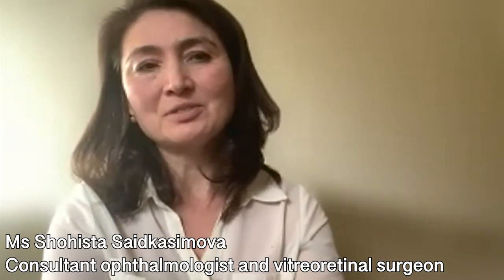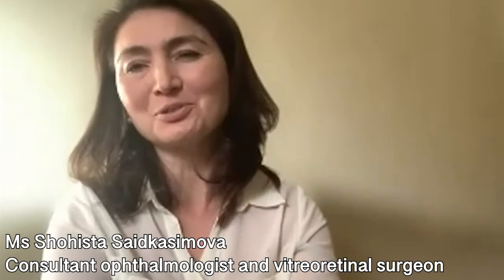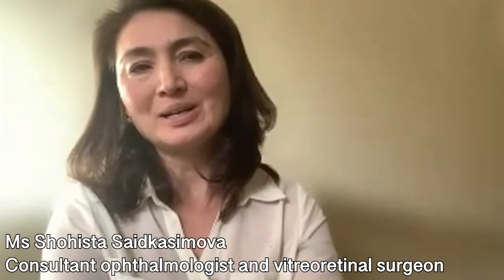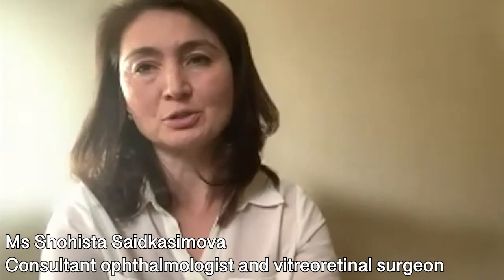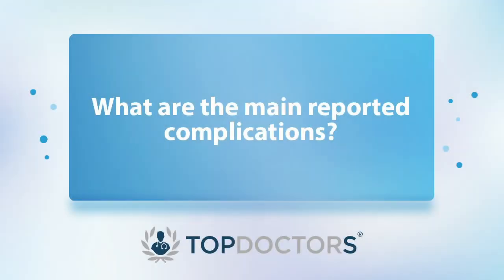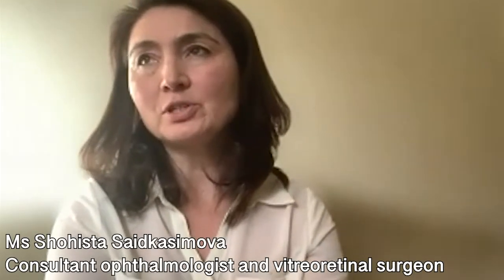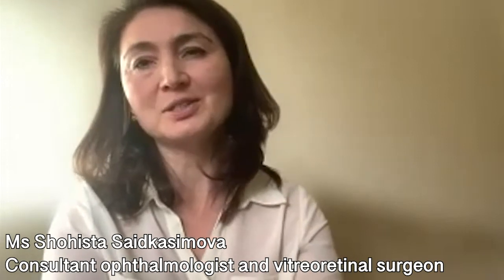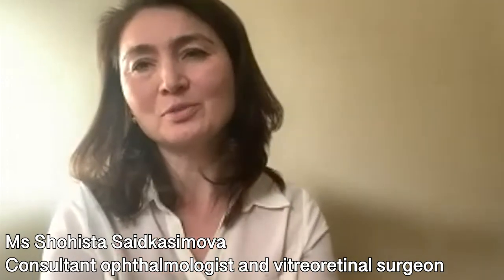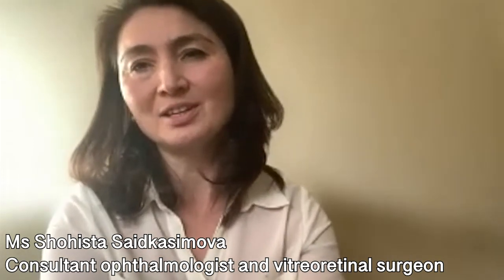So phacoemulsification uses very high frequency ultrasound, and we use quite a low power, so the damage to the surrounding tissue is minimal. The part of the procedure with cataract involves removing the nucleus of the lens. So we break it down into a very fine emulsified structure and aspirate it with the probe.